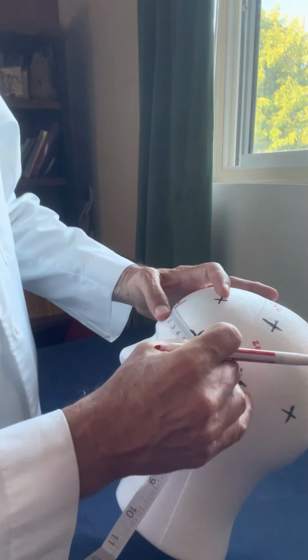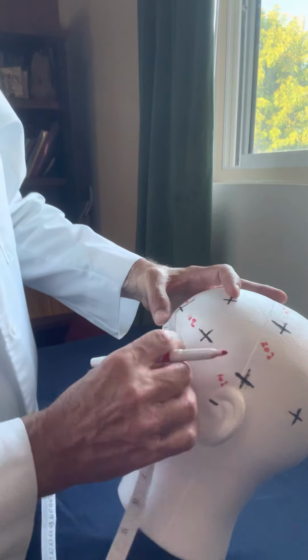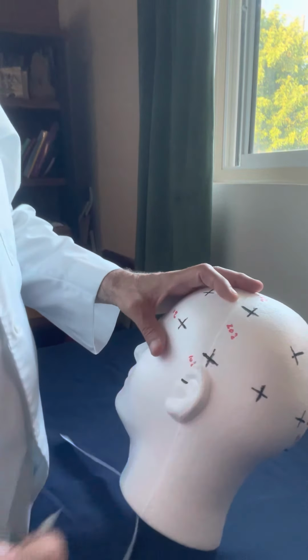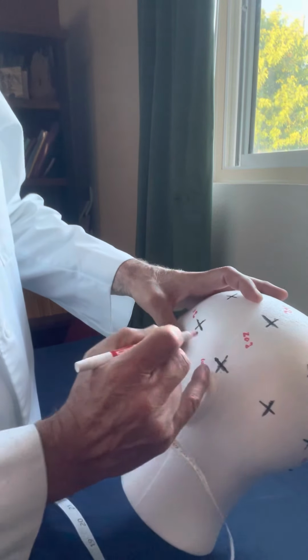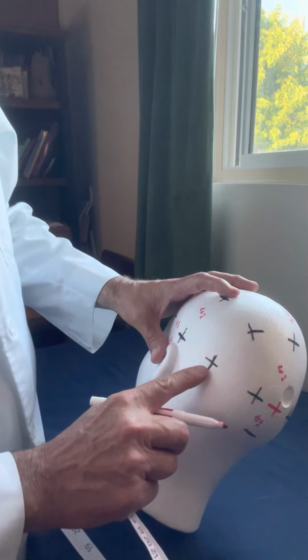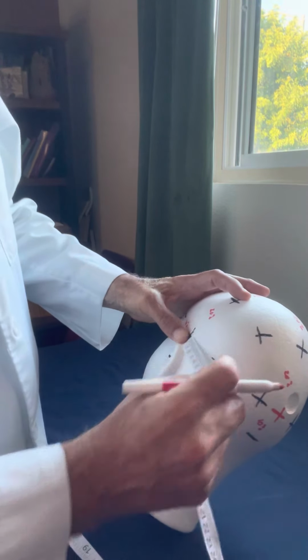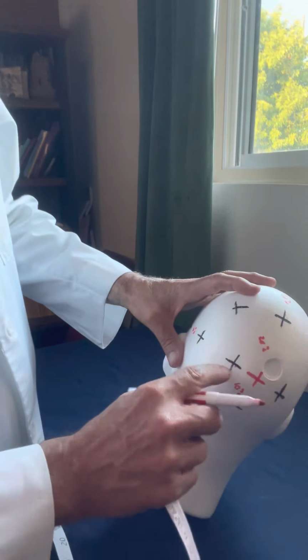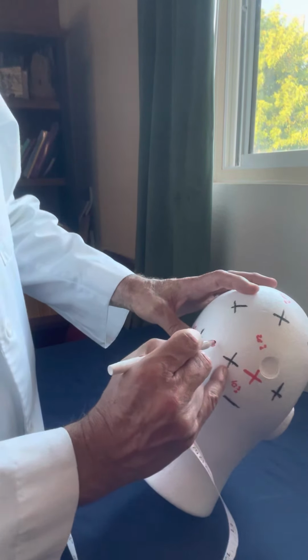Let's measure that. Okay, this is about 5.6 here, so this is 10% of the head circumference, from FP1 to F7. From F7 to T3, it's 5.5 centimeters. From T3 to T5, it is about 5.7 centimeters, or 10% of the head circumference. And then from T5 to O1, it is 5.3. So again, it's another 10%.